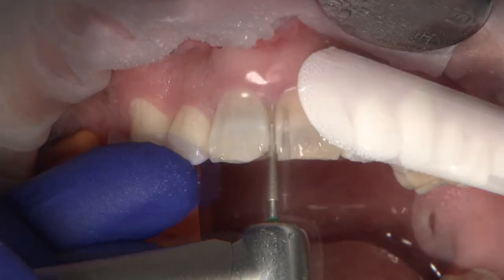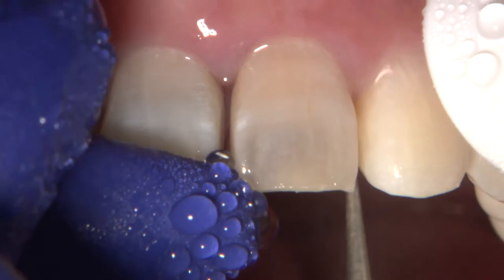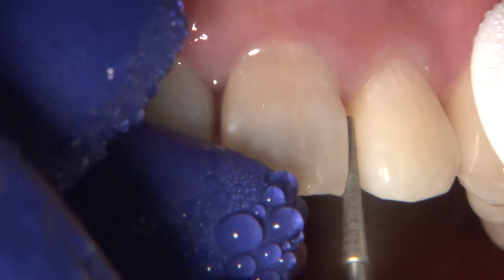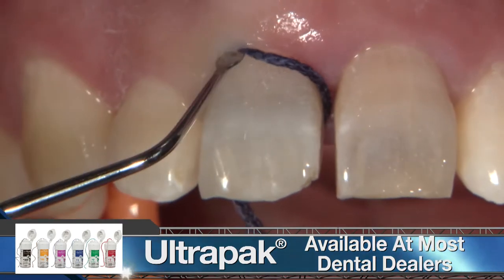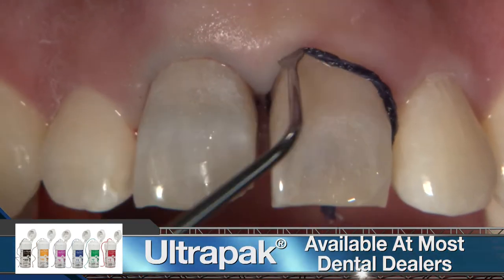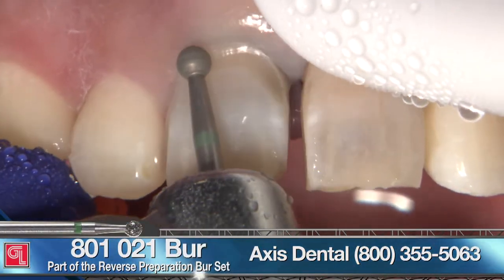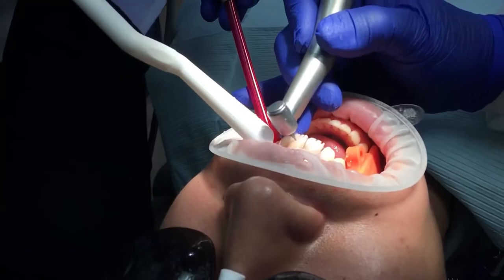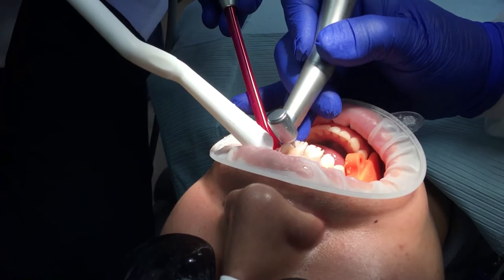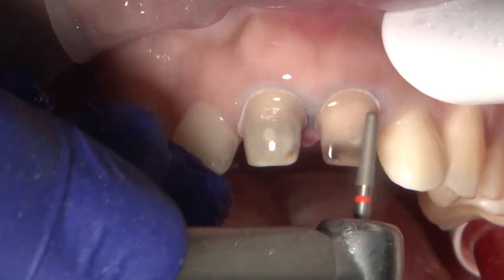Beginning with the 852G diamond burr from Messinger, I am cutting through the interproximal contact. The minimum material thickness for all-ceramic zirconia crowns is only 0.8 mm, allowing for a more conservative axial reduction, ideally being 1 mm. After packing a double-zero size cord, I am getting ready to place the depth cuts gingivally, incisally, and facially. With a round diamond burr, I create a 1 mm circumferential chamfer margin, and with calibrated depth cut burrs from Axis Dental, I reduce 2 mm incisally and 1.5 mm facially. Care must be taken when assessing the amount of incisal reduction necessary. Here, the right central was 0.5 mm shorter than the left, so only a 1.5 mm incisal reduction was done on number 8.